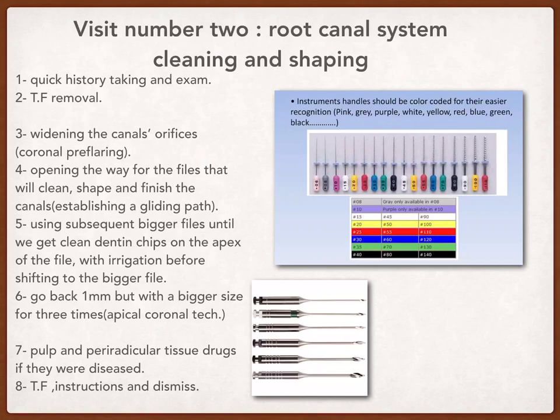And of course, the obturation, we can see during our practice that there are some gutta perchas that are over the apex or under the apex by 3 and 4 millimeters, and all of these situations are successful. But when the irrigation is bad, you will have a failure in your endodontic procedure.